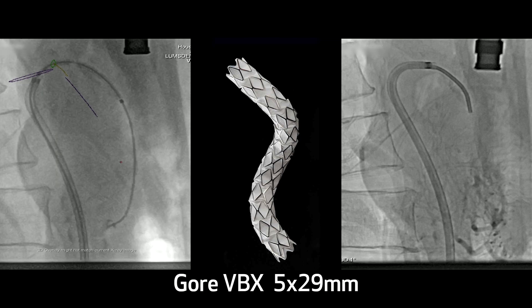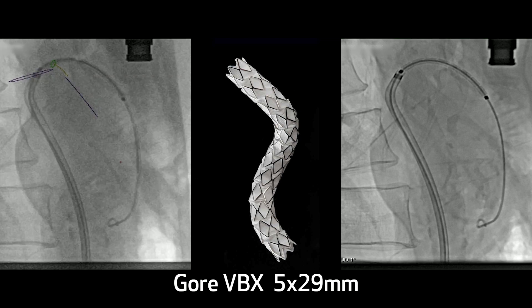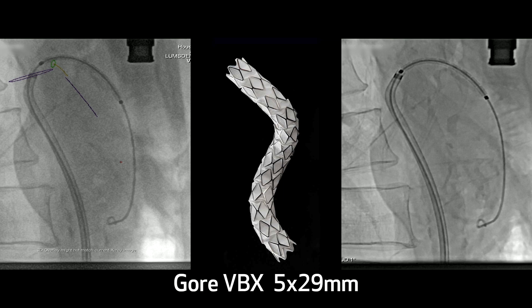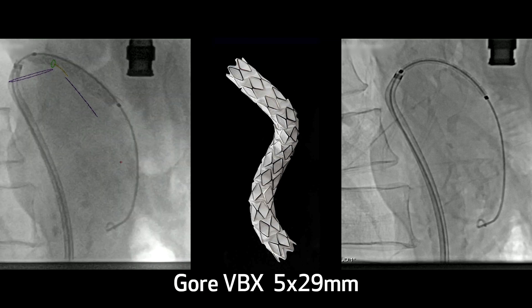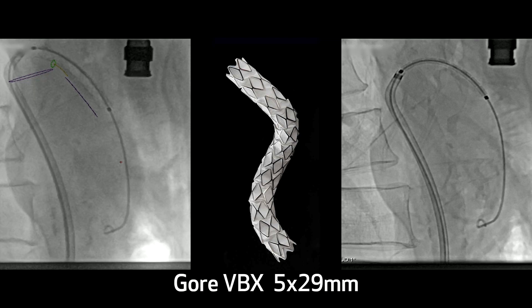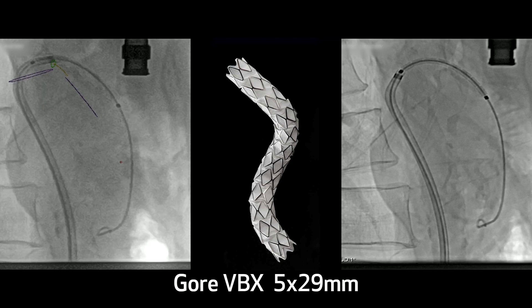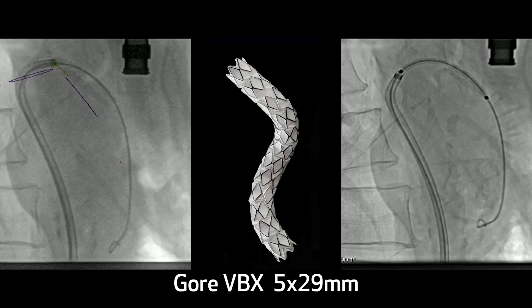These track really nicely even through a highly stenotic lesion like this. Obviously we're going to have to project this into the aorta — a lot of this disease is at the origin, so you want it 2 or 3mm into the aorta. We went ahead and inflated the VBX. It inflated pretty nicely. You can see the VBX being brought up into position. We manage the sheath much like we do with fenestrated grafts — as the balloon comes down, a little bit of forward pressure on the sheath. The sheath goes back inside the VBX to help protect it.